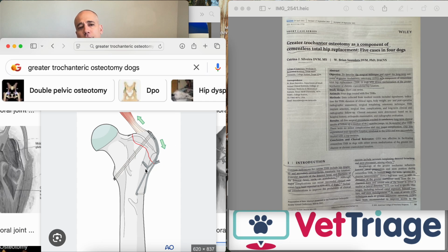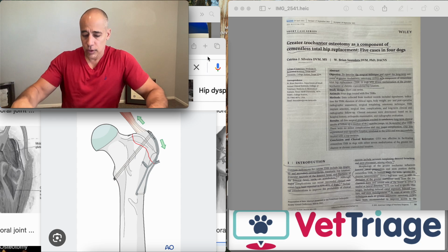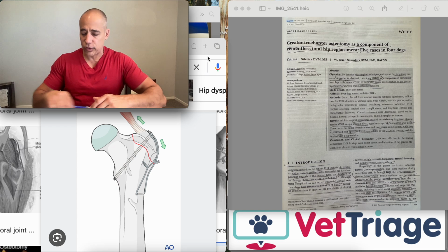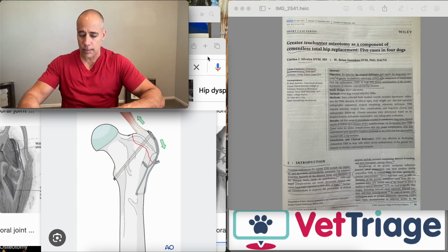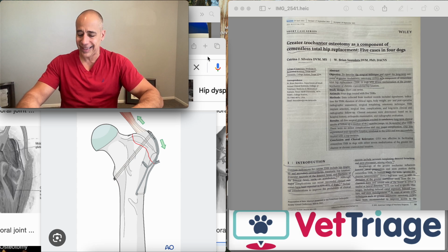But basically, they're trying to do this procedure to get better exposure for the total hip replacement surgery in dogs that have abnormalities associated with the greater trochanter where it gets in the way of the surgeon. All right. So this study comes out of Texas A&M University. The objective is to describe a surgical technique and report long-term outcome of greater trochanteric osteotomy as a component of cementless total hip replacement in dogs with severe medialization of the greater trochanter or chronic cranial dorsal hip luxation.